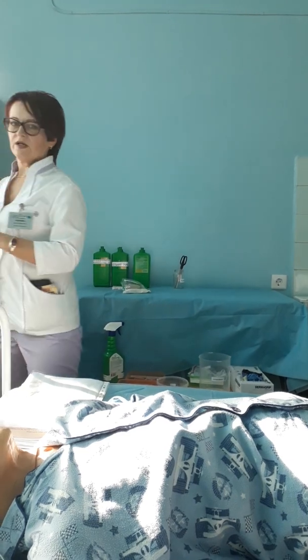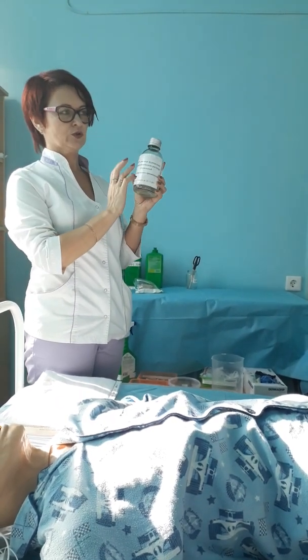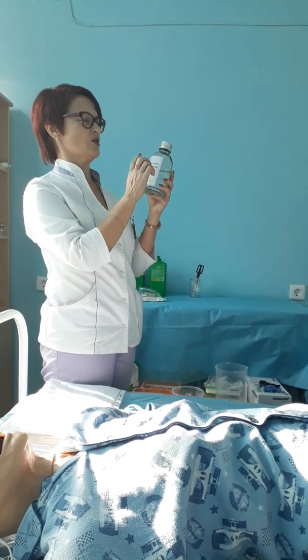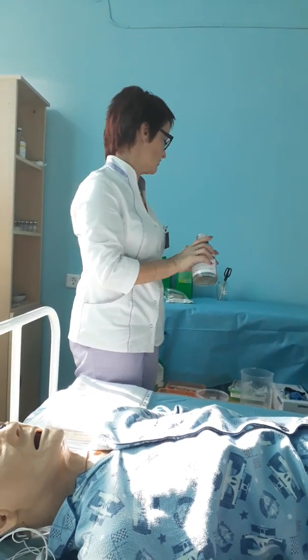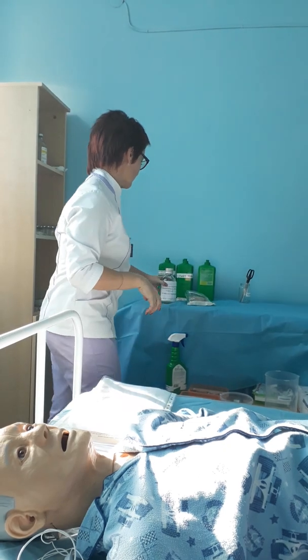You open your medical cabinet and take the solution. What will you check? Expiry date. Concentration. Volume. First you check the name of this solution, concentration, volume, and after that, color, appearance, expiry date, integrity, and current expiry date. Color: clean or not.